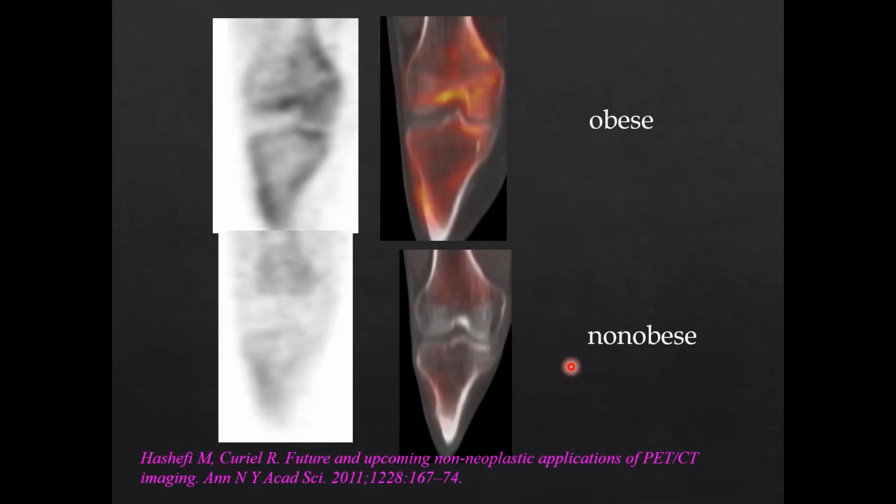So this is one of the things by which the knee joint is being evaluated, and on the same basis, osteoarthritis grading and staging are things which can be easily diagnosed and distinguished by PET in future.